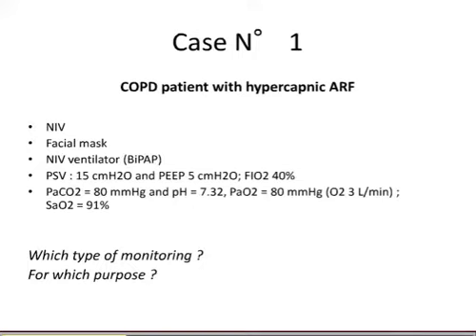What about transcutaneous CO2? We mentioned it yesterday. But honestly, who in the room is able to measure transcutaneous CO2 routinely in an adult? Yeah, I think two, three, four. Very good. So it's a good monitoring, maybe, but it's not realistic in daily life.